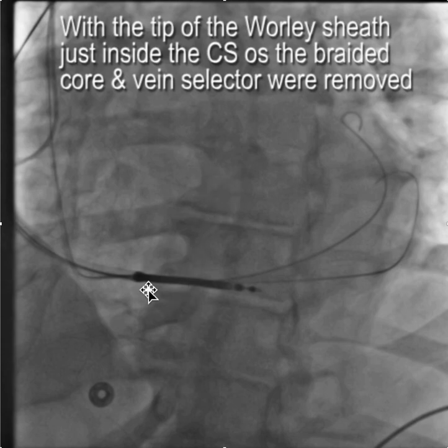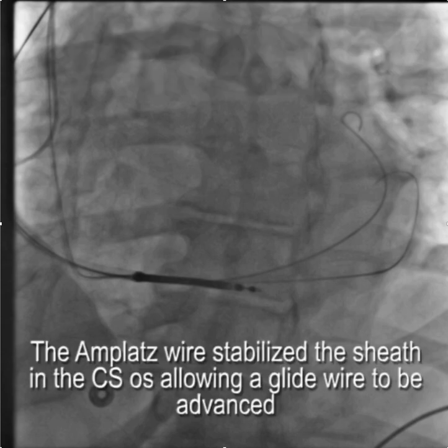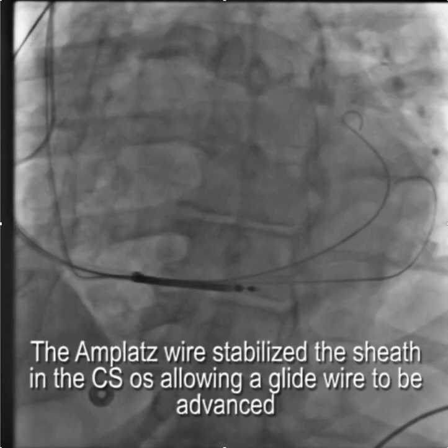With the tip of the Worley sheath just inside the coronary sinus, the braided core and vein selector were removed. Then with the tip of the sheath in the coronary sinus, we advanced the glide wire into the target vein. This was possible because the amplatz wire was here stabilizing the sheath, and the tip of the sheath was deep enough into the ostium of the CS that the glide wire went right in.